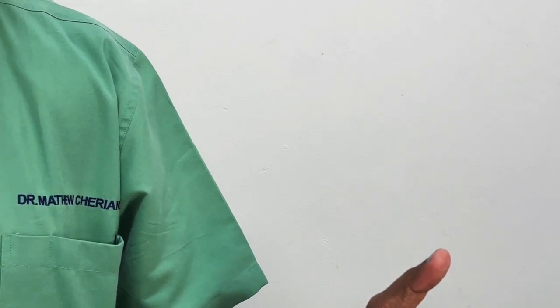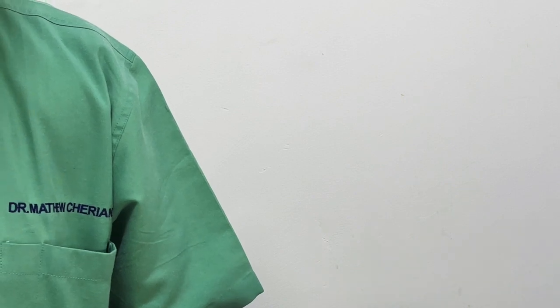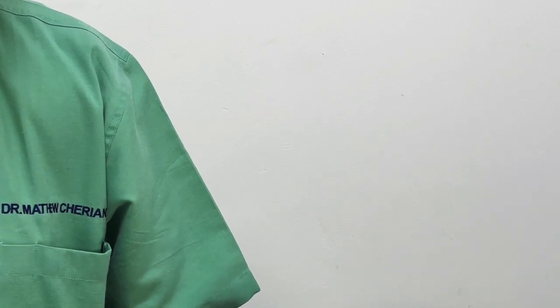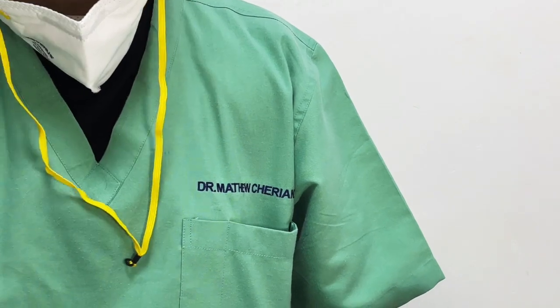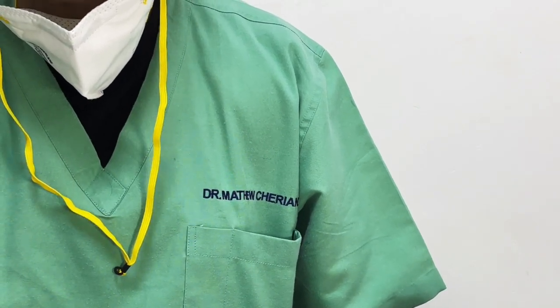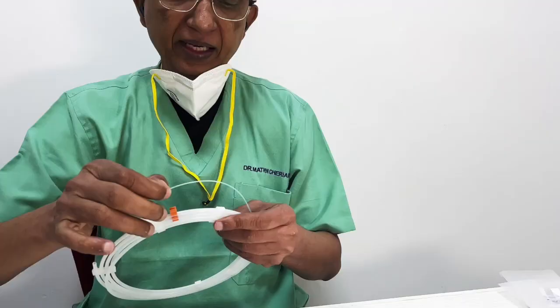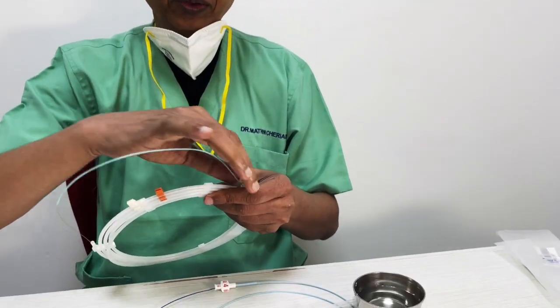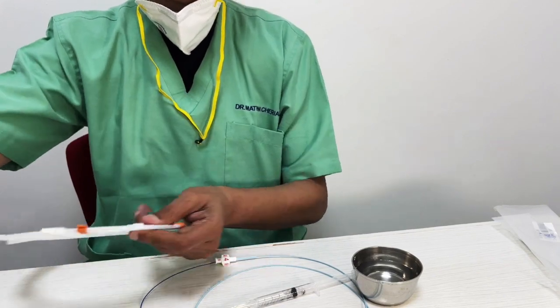One of the things you're going to notice is that it does not have any fiber. So remember that there is no dacron fiber, there is no dacron mesh, and occlusion here is mechanical. Though thrombus will form, that takes time, so you have to obliterate the lumen completely.